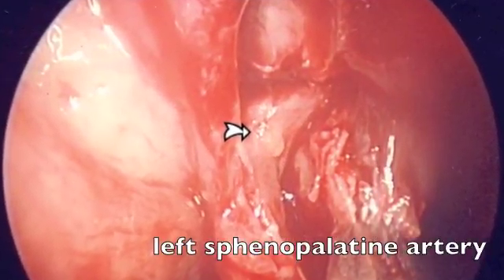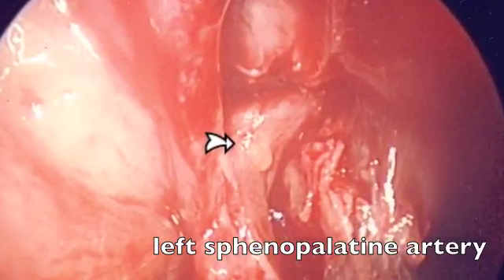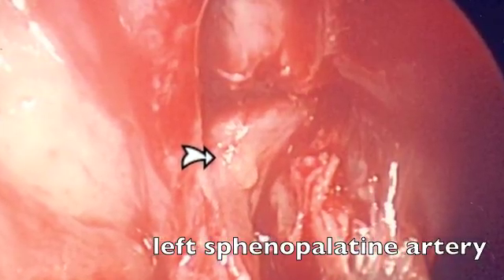Another endoscopic view, this showing a patient on the left side with their sphenopalatine artery exiting through the sphenopalatine foramen, and the mucosa being lifted up.